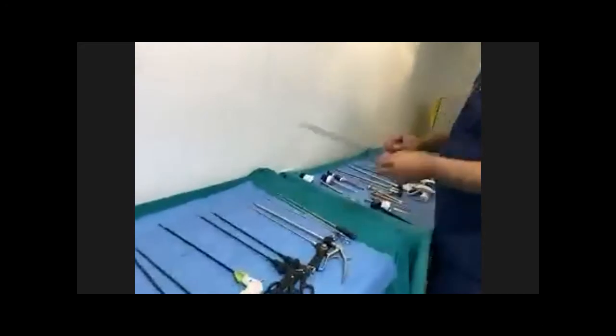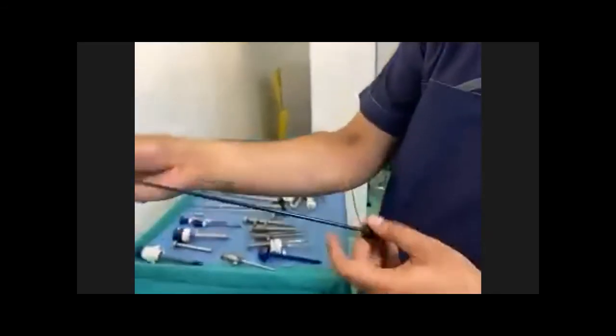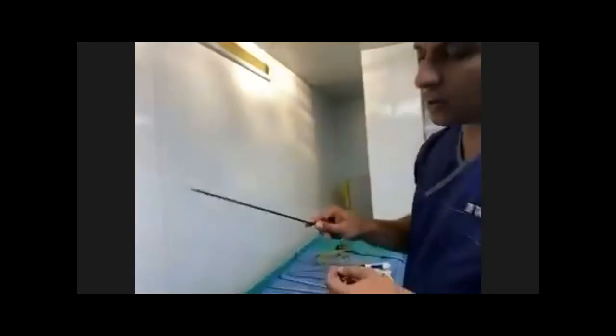Okay, this is another instrument just like the L-hook, but it is called a spatula. It has a flatter end, like you see, and you can attach this to the cautery. So it is used in the liver bed or at places where you want to have a cautery with a blunt end.